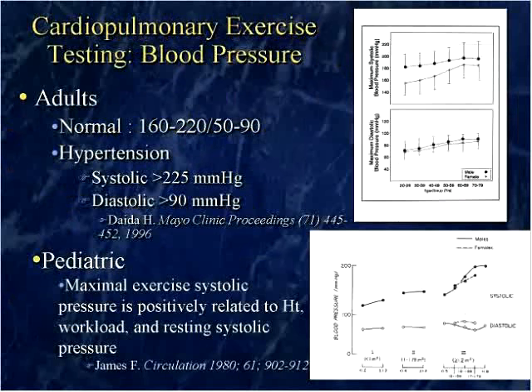If their blood pressure continues to fall, make sure you communicate with the patient and stop and cool down at that particular point. And these are the definitions of hypertension for you that are on the slide.